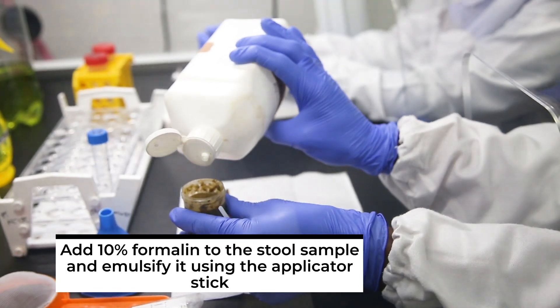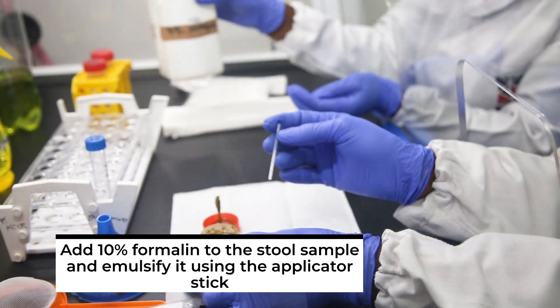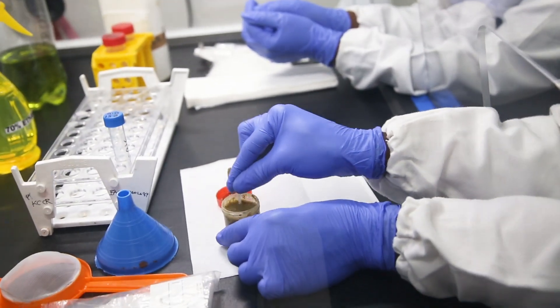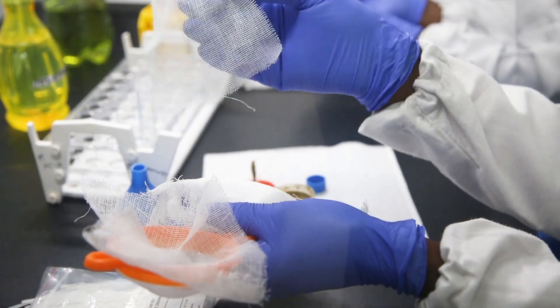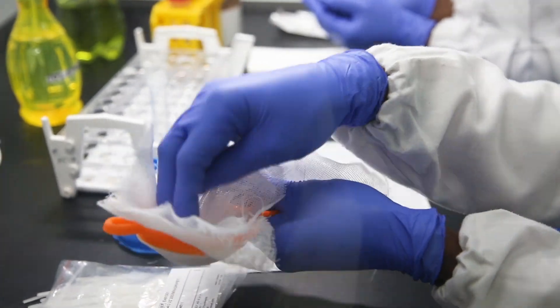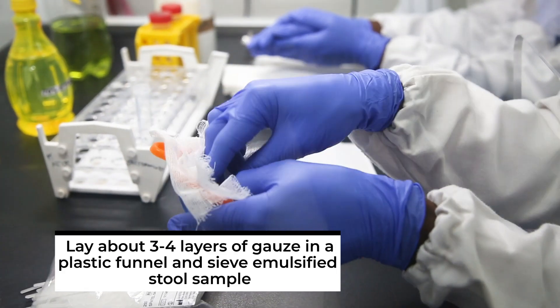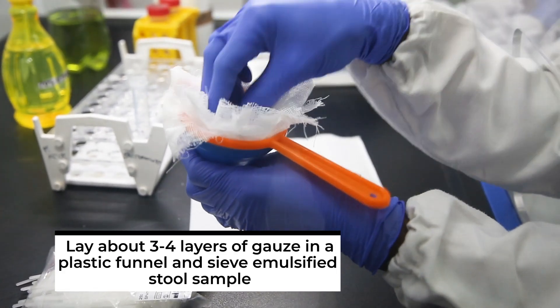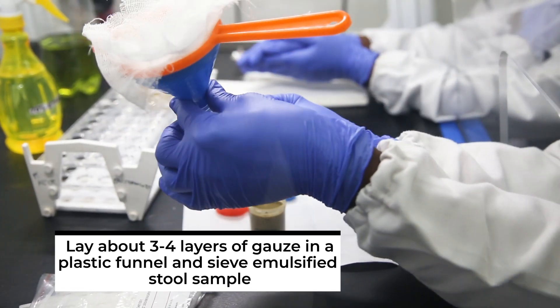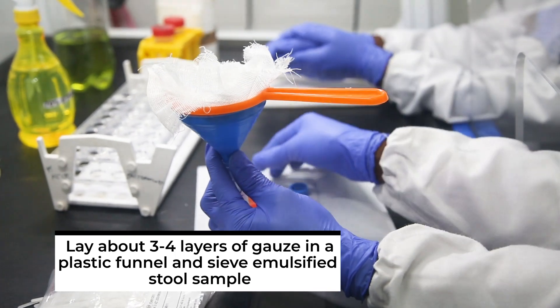You add 10% formalin to the stool sample and emulsify it using the applicator stick. The formalin here preserves the stool and parasites that may be present in it. Note that the stool here came already in formalin, so we only top up with some more formalin. You pour some of the emulsified stool sample into the sieve and sieve it by means of a plastic funnel after overlaying about three to four layers of gauze in the sieve.